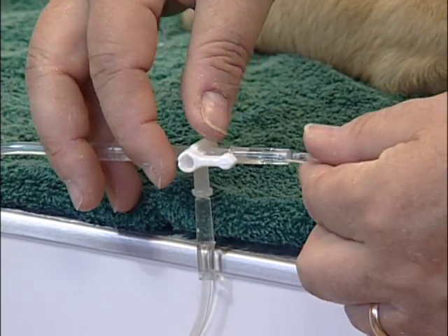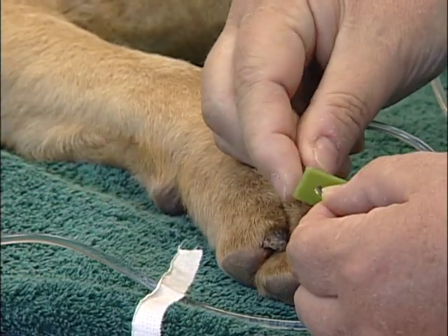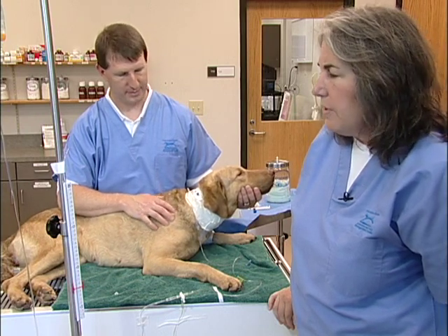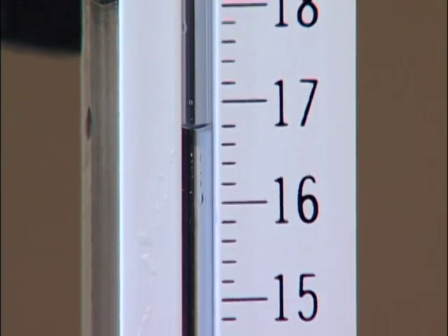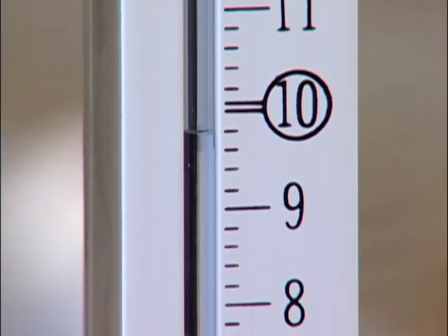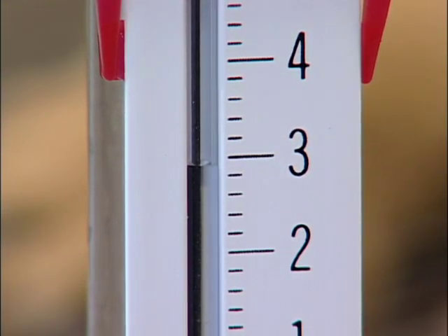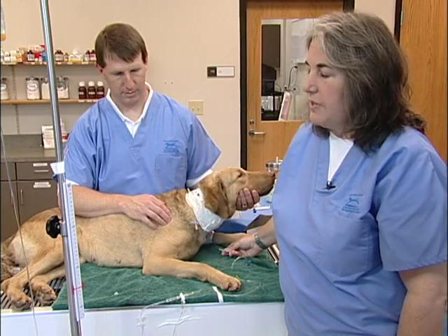Now that the manometer is filled, I can actually turn the stopcock off to the bag and open it to the dog. You can actually see the fluid level as it moves through the manometer tubing. It will continue to fall until it equilibrates with the level of fluid in this dog's heart right now.